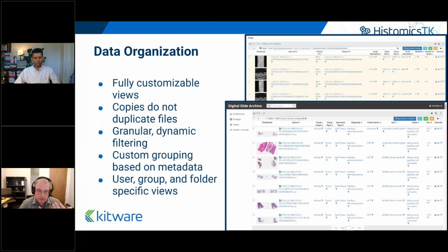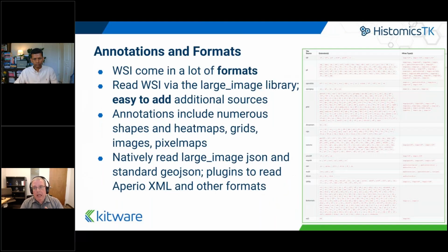And so this is all designed to be granular as needed for your project. You can group it as appropriate for your particular research task. It's not a one size fits all. It's very much we can tailor this to how you need to view it. All of this is publicly published, so you can figure this out on your own. But if you don't want to spend your time doing that, then that's where we can come in.